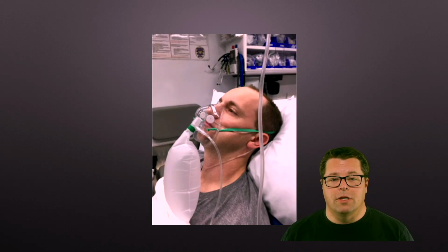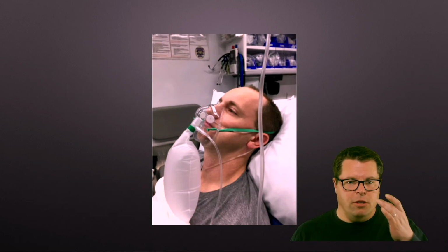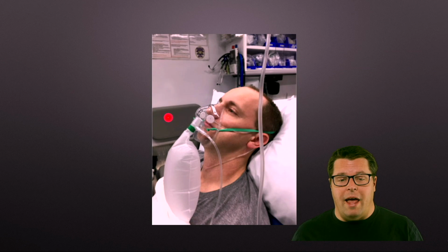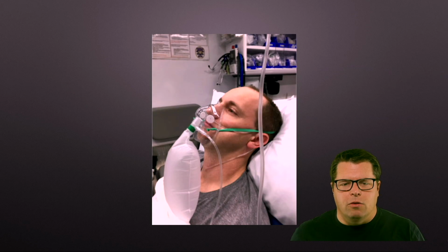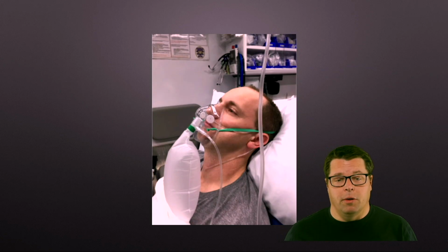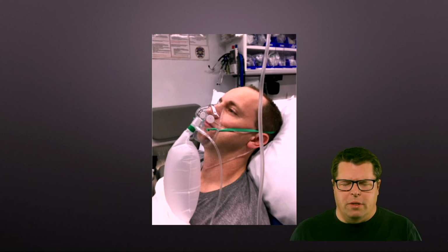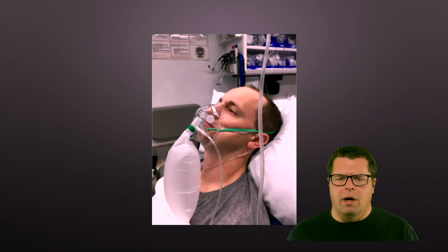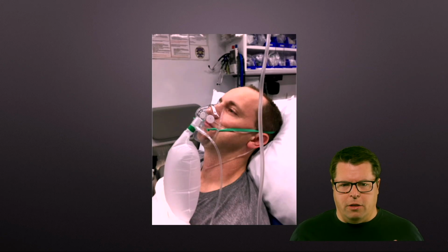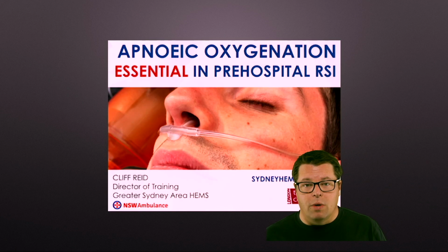So how many of us have ever tried this before? Putting an end tidal CO2 sensor on underneath a non-rebreather mask. And you'll see people say, well, that won't work. Well, yeah, actually it will. They are theoretically going to be pushing all that gas outside of the mask itself, and well, it wouldn't be in the end tidal CO2 sensor anymore. So you can use an end tidal CO2 sensor on a non-rebreather on a spontaneously breathing patient. And you can even turn up the oxygen flow through it and sometimes provide the person a little bit more inspired oxygen. Though at that point, we probably should be looking at BiPAP or CPAP, but you could do it. So yes, you can use it under a non-rebreather to at least monitor breathing.